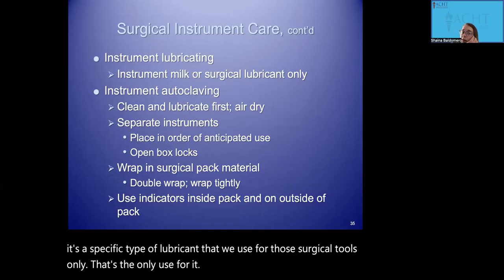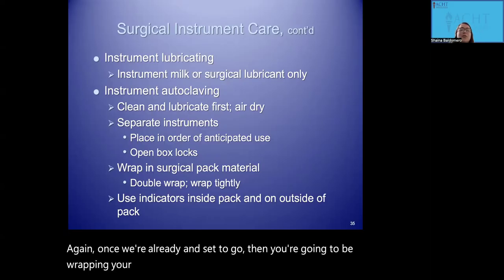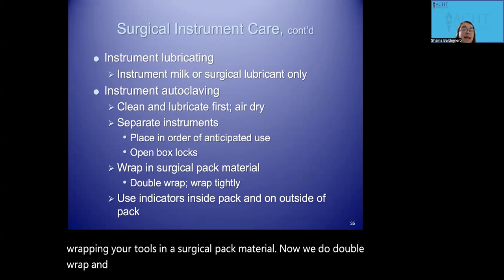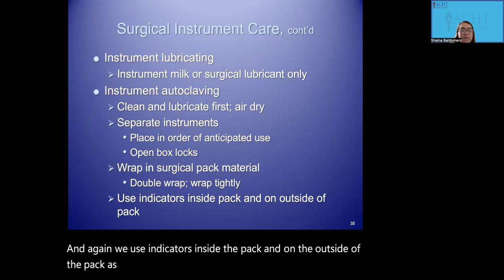Again, once we're all ready and set to go, then you're going to be wrapping your tools in a surgical pack material. Now, we do double wrap, and we wrap these tightly. And again, we use indicators inside the pack and on the outside of the pack as well.